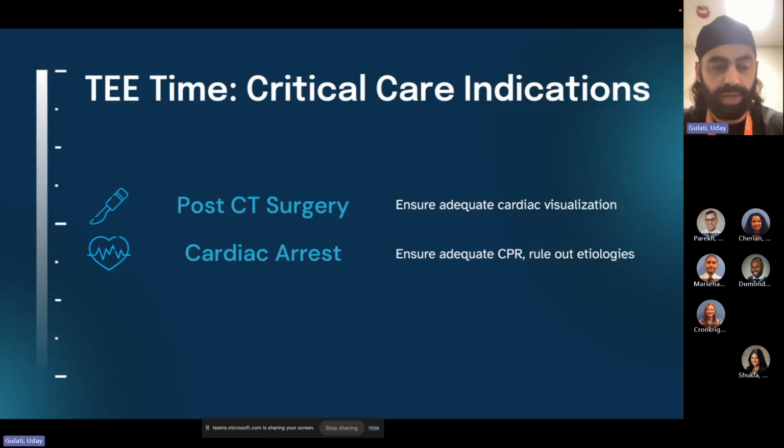So post-CT surgery, right? We talked about, you guys have been in the OR at Atlanticare. You see that there's an anesthesiologist with a TEE probe that's just left inside the patient, for patients that require cannulation, for patients that require valve assessment, valve repair that's done through the vessels instead of open. You'll see that they have that probe and they're getting constant visualization. But what happens when you're taking care of these patients after they come to the CT ICU?